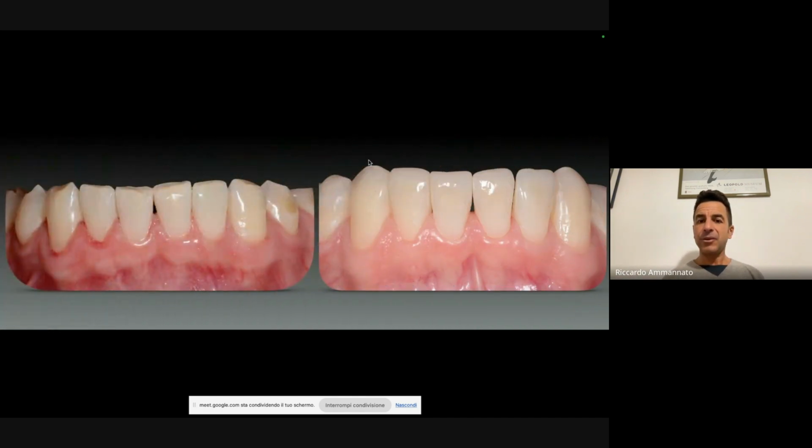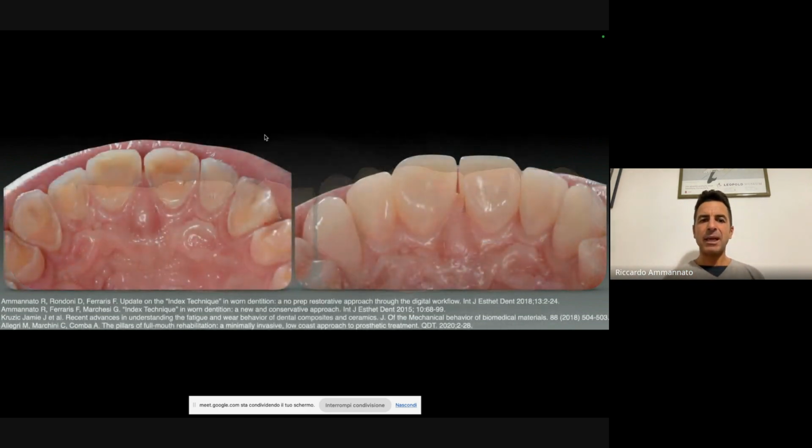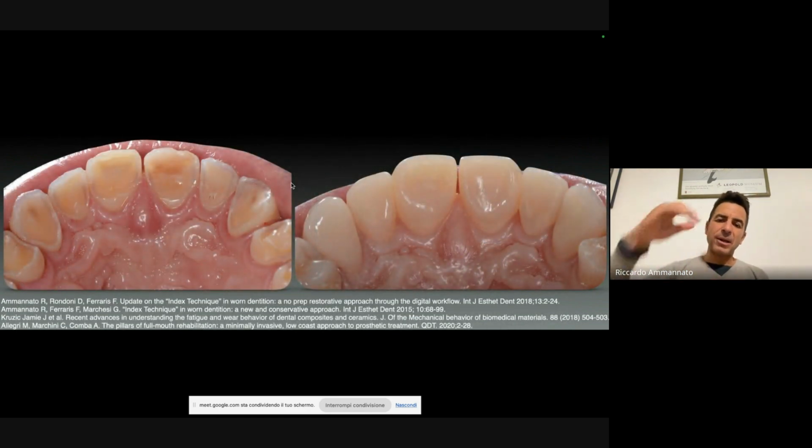Okay, this is the anterior before and after. So we have the moldings and we have the canines that are cemented. You can see it here from this side. All this tip is in glass ceramic, and then we have the glass ceramic on the lingual side. This is the functional part, the internal part of the upper. So with the molding from lateral to lateral, and you see the canines here with glass ceramic.